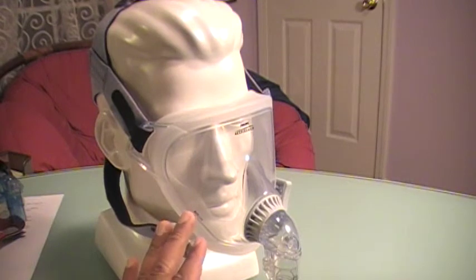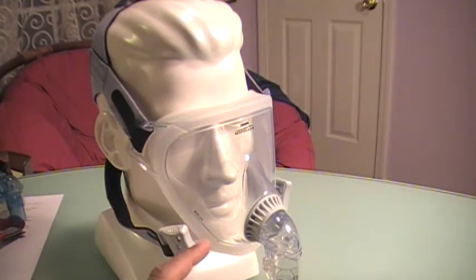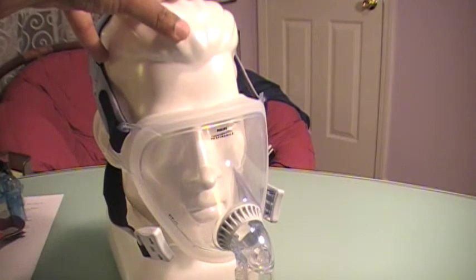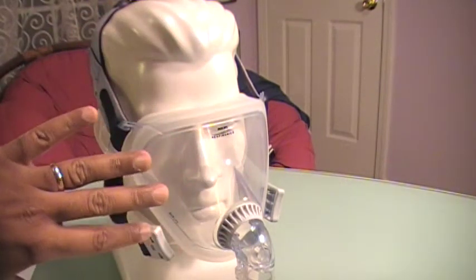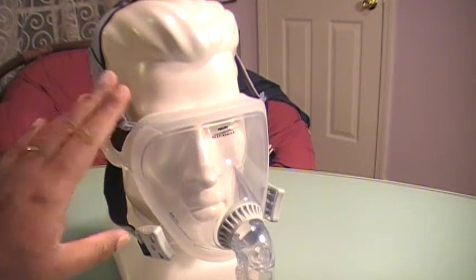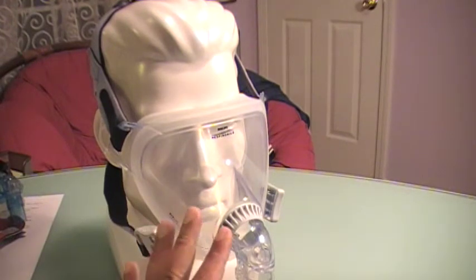This mask is good for mouth breathers. It's good for somebody who's having really high CPAP and BiPAP pressures. It works really well for back sleepers. Somebody who has a lot of facial hair — this works well. Stomach sleepers — yes, it works good too. Side sleepers, however, it is not effective; you will experience a lot of leaks.